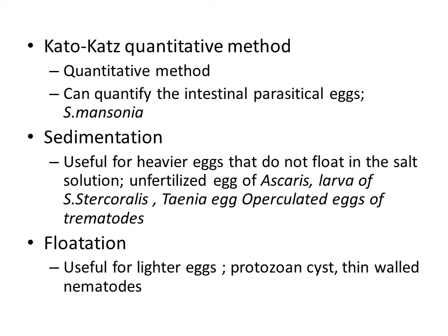A sedimentation technique is very useful for the heavier eggs that do not float in the salt solution. According to the weight of the eggs, some are deposited and some are floated.